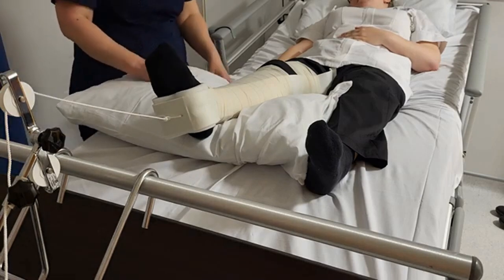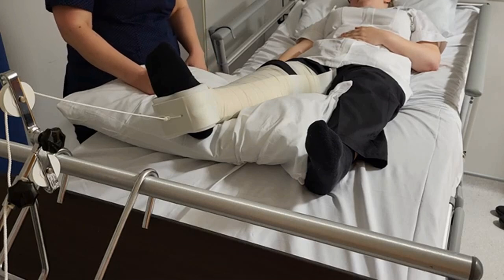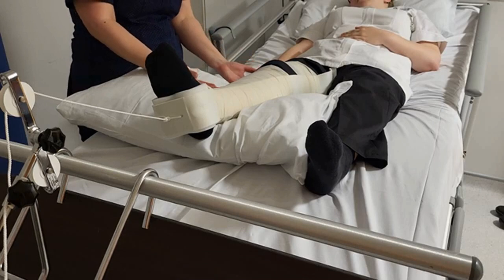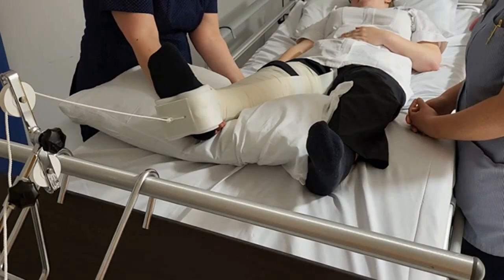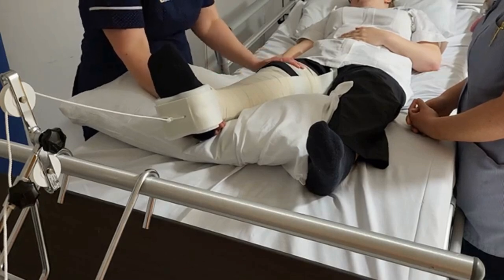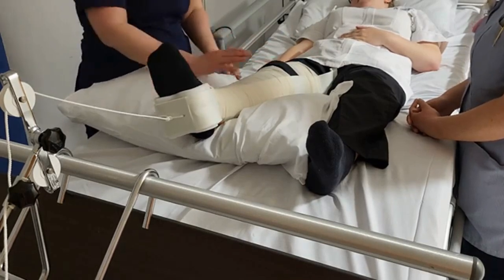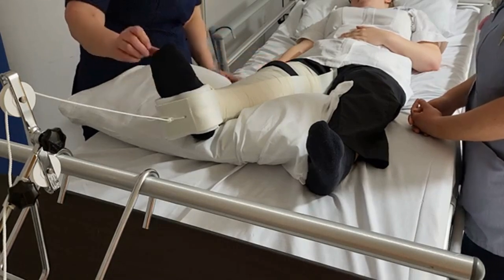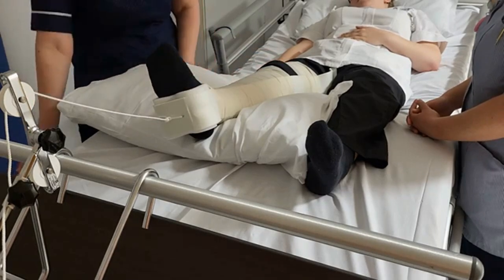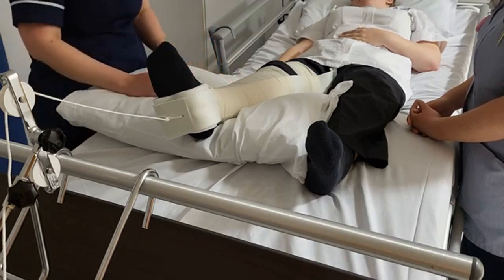With regards to toileting, the patient will need to use a bedpan, or bottles if they're a boy. This is tricky but we can help support and encourage the child. Always good to have someone supporting the leg while you slide the bedpan under. Reassure the child that we do this all the time. It often results in wet beds and sometimes wet bandages, in which case we need to change the bandage and the bed to ensure there are no wet bandages on the skin causing soreness. Encourage parents to keep a close eye on the traction — if it's coming loose, toes are cool and not wiggling, or the weight is touching the floor, they should call the nurse to redo the traction and maintain pain relief.